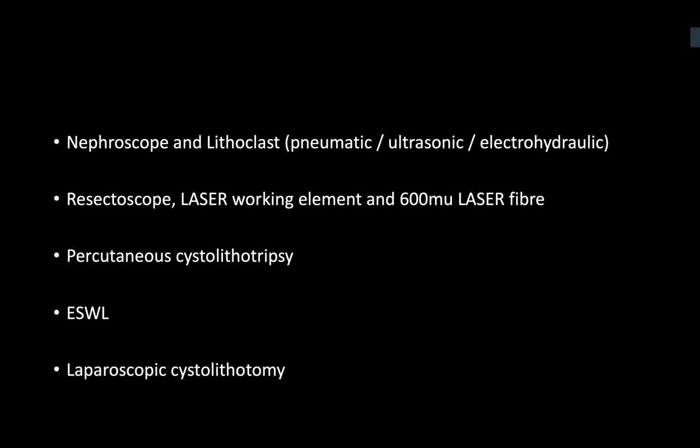So apart from the mechanical lithotrites, what are the other options that you are aware of? I'm aware of those which induce lithotripsy using energy. So there's electrohydraulic and pneumatic lithotripsy, and also ultrasonic lithotripsy, and laser could also be used with bladder stones. Okay. What about shockwave lithotripsy?